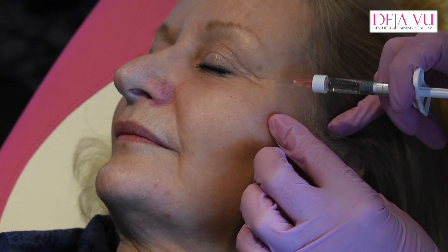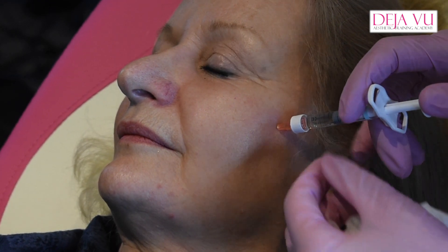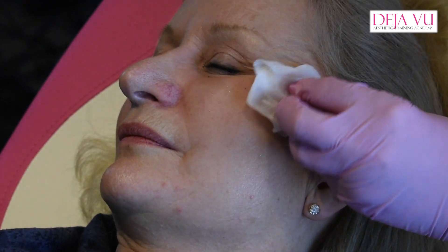Do you want your head that way for me? I'm feeling for the cheekbone. When we do the actual training course for advanced, we do mark-up. But as I said today, it's not a training course.